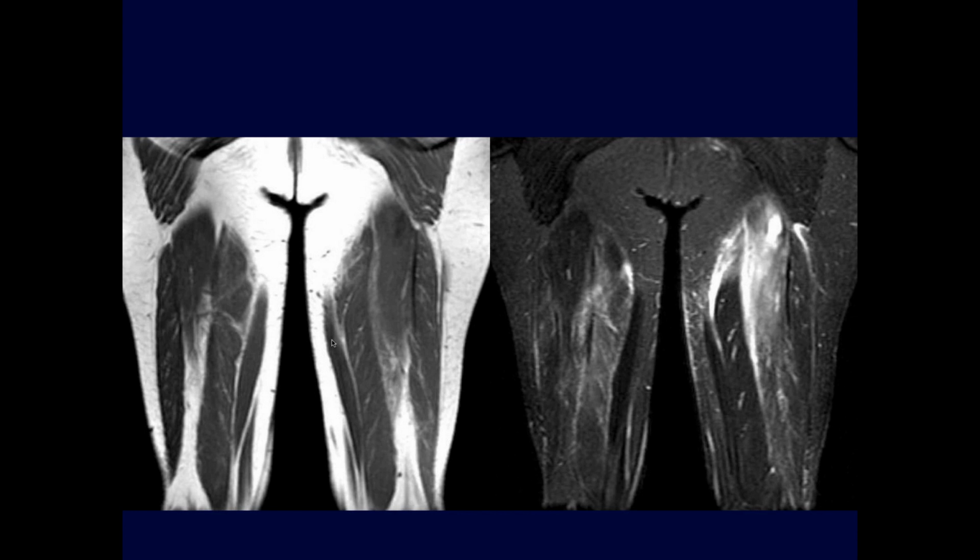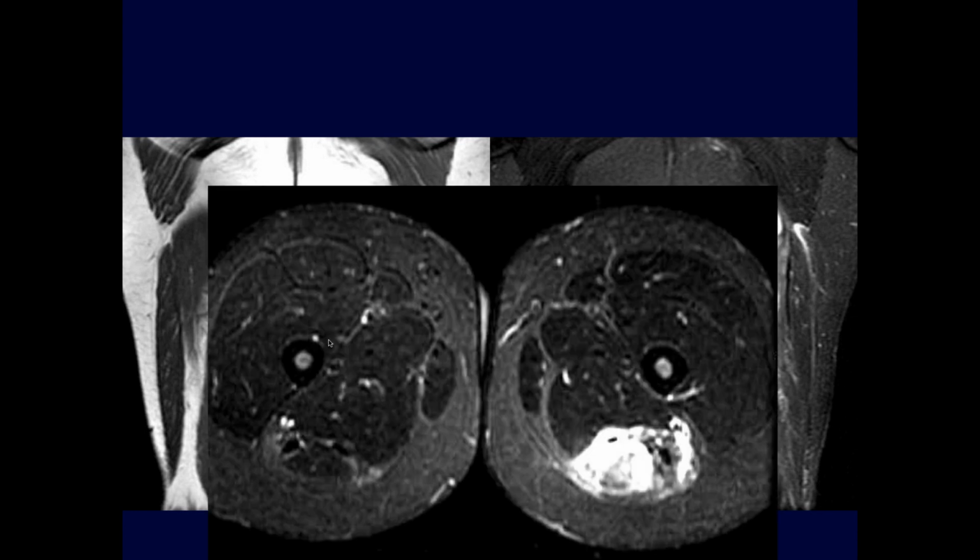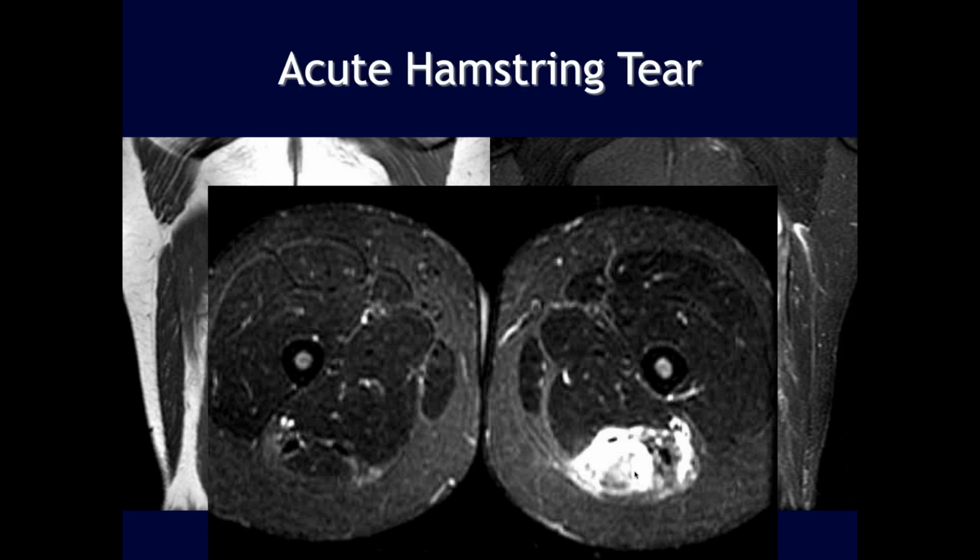Okay. So there's a lot of edema and fluid tracking along that left. It was a posterior thigh, like in the hamstring, I believe. Yeah. So there's quite a bit of edema involving the semimembranosus, semitendinosus muscles on the left. So I'm concerned for a hamstring tear, but the biceps femoris looks okay. The biceps femoris, I think, is okay. Why do you say that? No, never mind. It's just involving the entire hamstring.